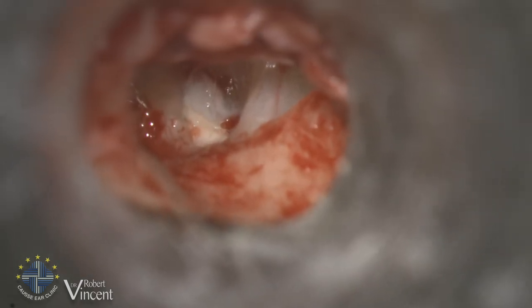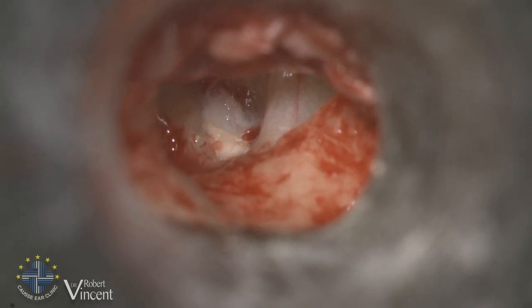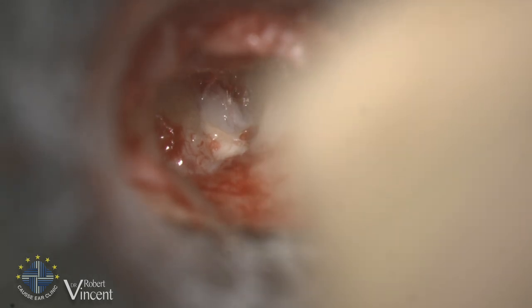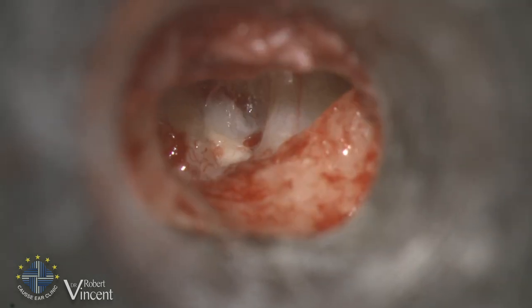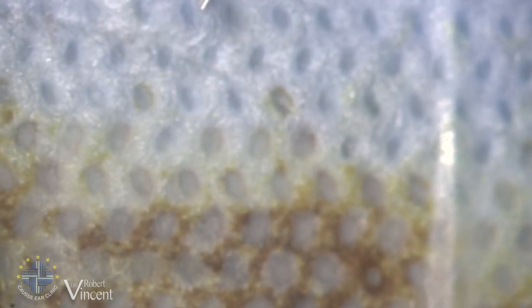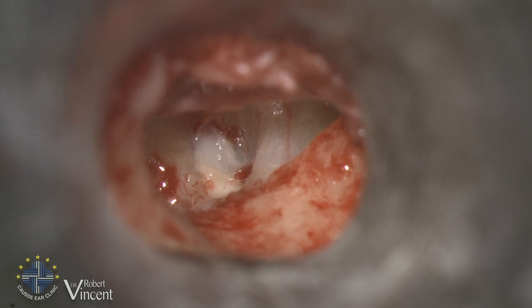Now we have to choose the position of the malleus prosthesis. We need to make two holes through the bony canal wall. I'm using a 0.6 millimeter diameter diamond dust bur to perform the two holes.